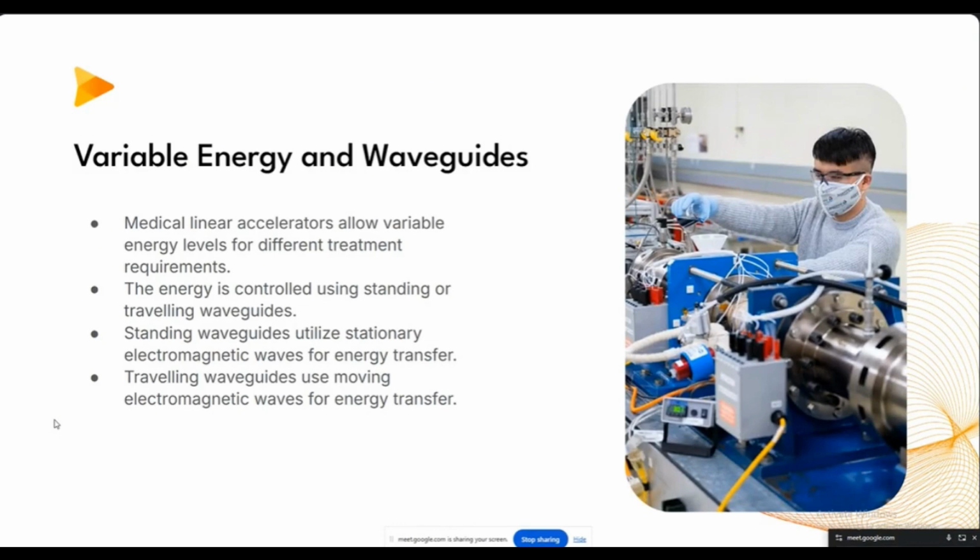The same way, when the RF wave follows an electron from behind, those electrons fall in that electric field, but because of the constant RF wave from behind, the electrons again go to a higher energy state and then accelerate. So those small accelerations add up together, and the electrons are accelerated using a traveling waveguide. That is an example of a traveling waveguide.